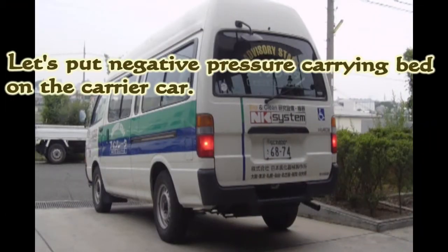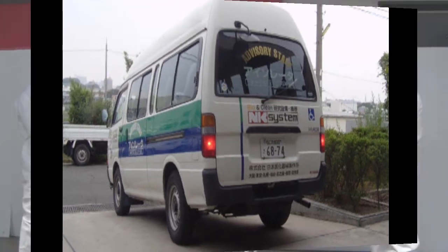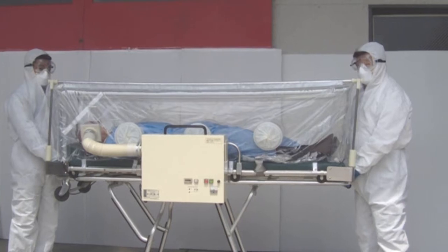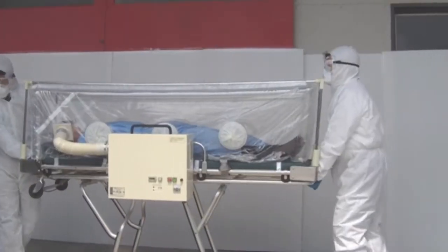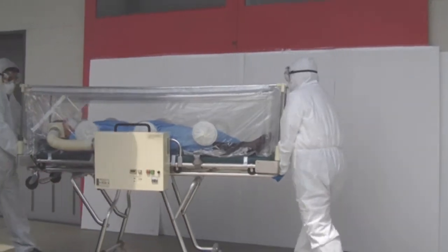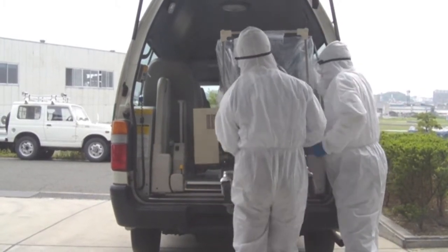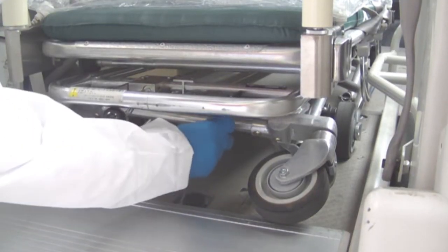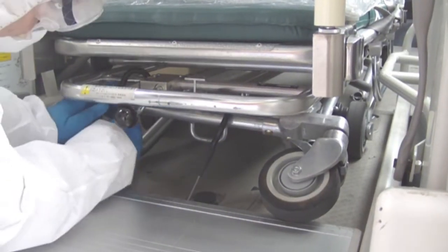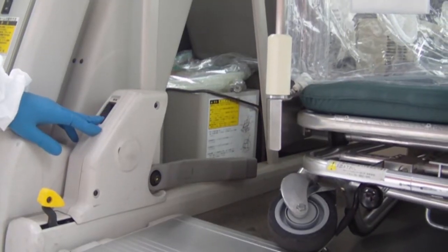Let's put the negative pressure carrying band on the carrier car. The stopper of the negative pressure carrying band is turned off. The negative pressure carrying band is placed on the carrier car. The belt fittings that fix the carrier car and negative pressure carrying band are installed.